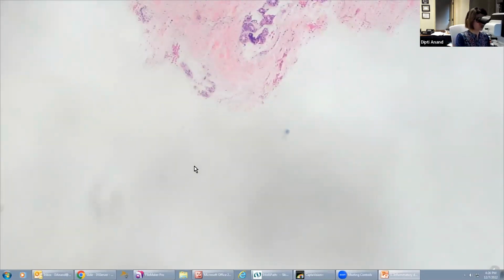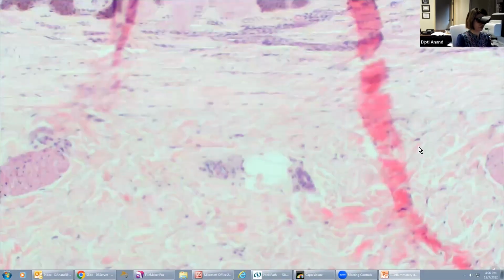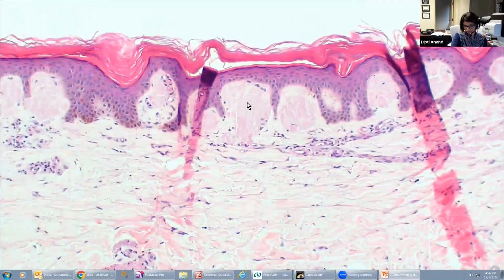So macular amyloidosis. Macular amyloidosis, again, is an invisible dermatosis. Not much is happening. You will go from top to the bottom, and when you go down into your papillary dermis, you will see these amorphous acellular pink deposits, which are filling and expanding the papillary dermis. Macular amyloidosis most often presents as hyperpigmented patches on the back of middle-aged to elderly females, and you get some degree of pigment dropout, but it's very post-inflammatory. You do not get much inflammation.